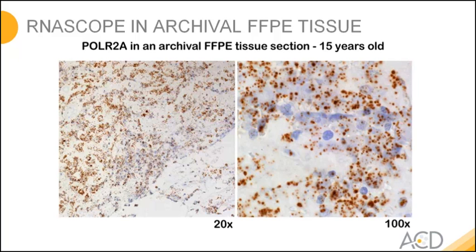So for some of the transcripts in this tissue, the target region is compromised and it can only load a few Christmas trees, forming a small dot, whereas other targets have the target region for the probe fully intact and they load 18, 19, 20 Christmas trees and this forms a big dot. However, you digitalize the readout in a way that you count the dots rather than interpreting shades of brown. So it takes out some of the objectivity.